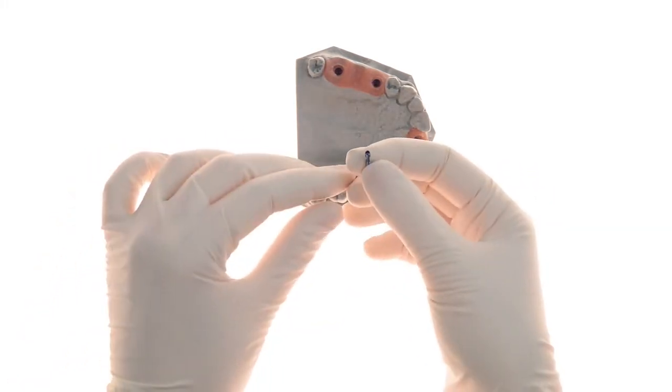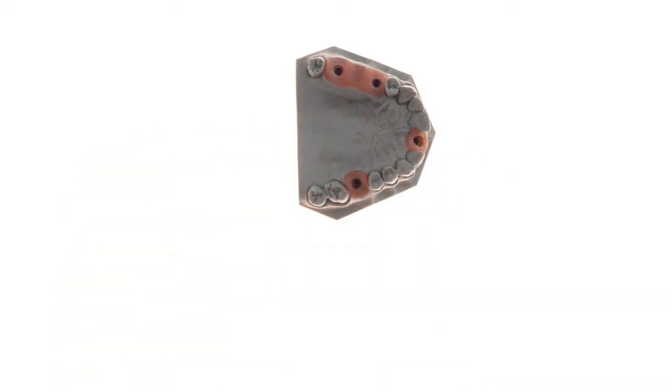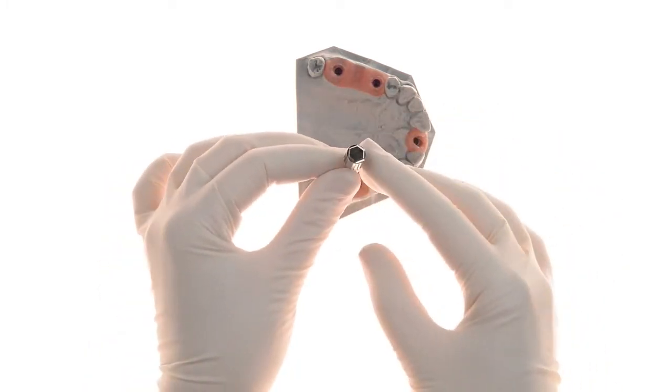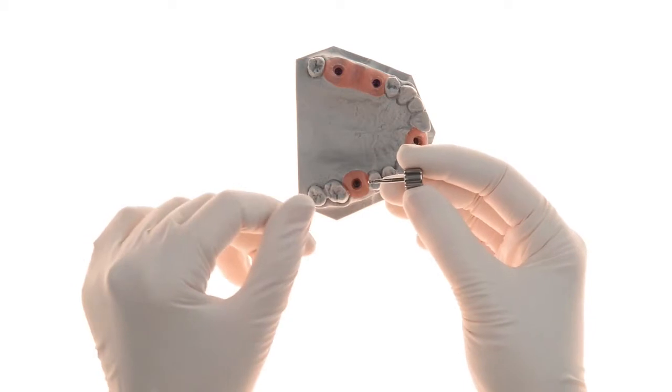This is the specialized screw that comes with the EasyBase, and this is the specialized screwdriver which has a unique tip. This design allows safe access from multiple angles, even up to 20 degree angulation.